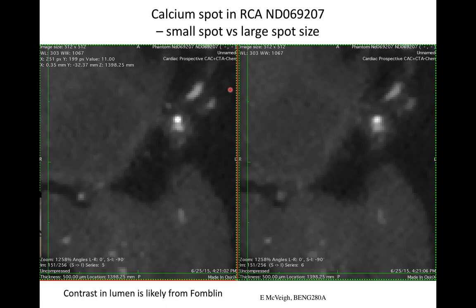What's interesting here is when we image this, we got this picture. So this is the arterial wall here. This is quite a good picture because it's not moving or anything. You take time to do this. So here's the arterial wall. This is the lumen of the artery, and this is a piece of calcium, right?